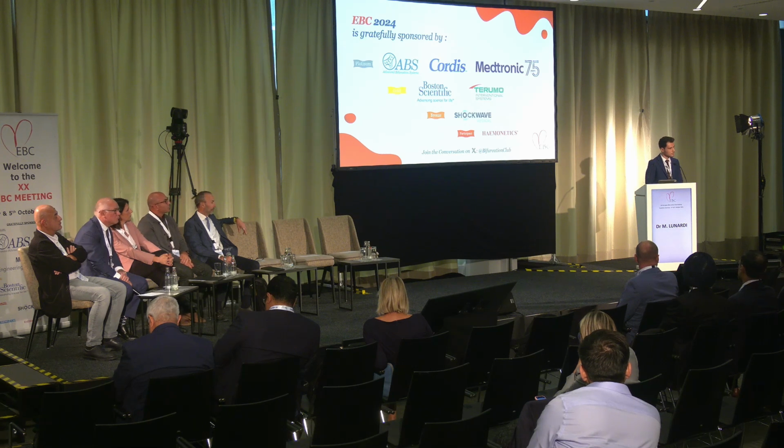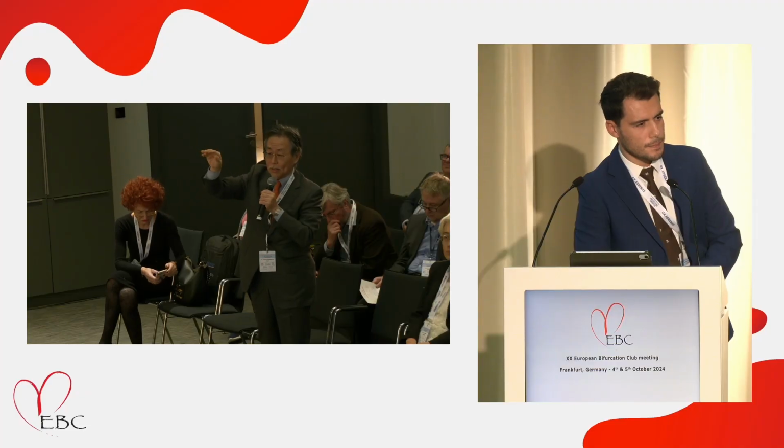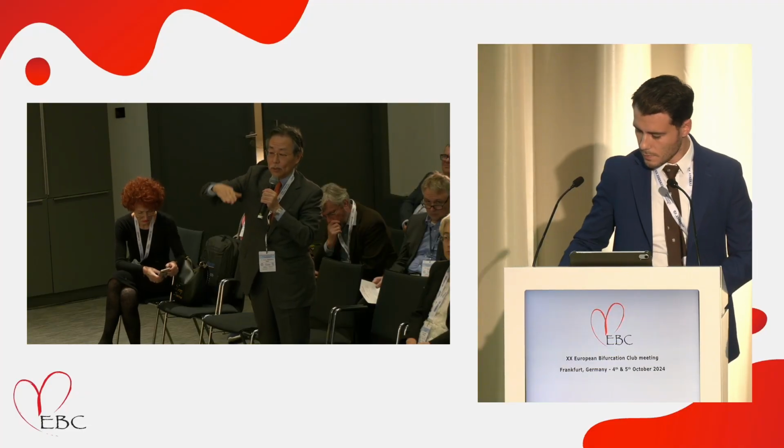I would like to ask where the malapposition side is after the side branch dilation. Usually, when side branch dilation is performed, the malapposition is likely to occur on the opposite side of the side branch. Is that right? Sorry, could you repeat? When you perform the side branch dilation, malapposition occurs at the LAD. Where is the malapposition side? The opposite side of the LCX?